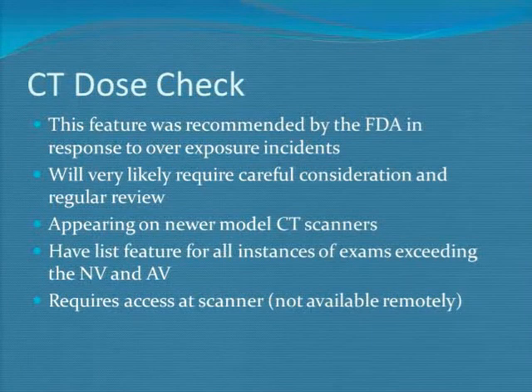So this process was really recommended by the FDA several years ago in response to the repeated overexposure incidents. This was something the FDA kind of went to the manufacturers as a group and said, we got to do something about this. And this was the response. It's very likely to be needing to be reviewed on a regular basis.